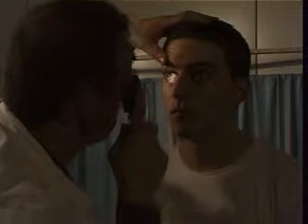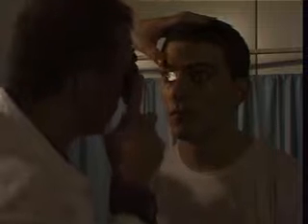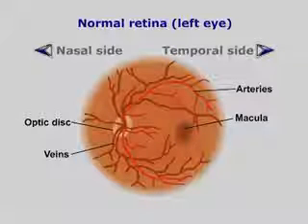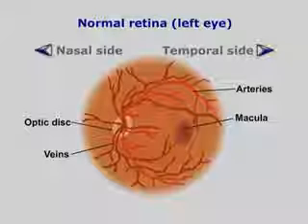Slowly move closer to the patient. At the same time, gradually reduce the power of the diopter lens whilst examining the cornea, the lens, the vitreous body, and then the fundus until you're about 2 inches away from their eye. The power of the lens needed to focus on the fundus will vary with each patient. By adjusting the lenses one step at a time, you will be able to locate and focus onto a blood vessel on the fundus.